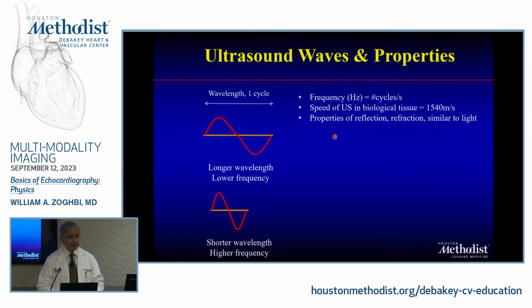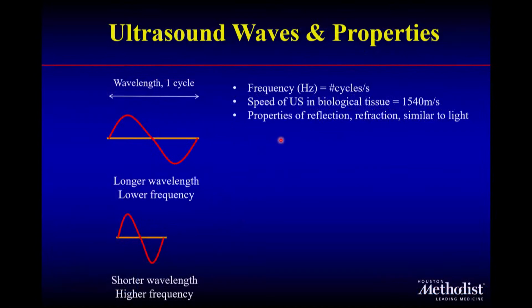When you have a transducer that has all these crystals at the top of the transducer, just like you see here, you can excite it with electricity. You could excite it mechanically, and these are mechanical ultrasound, you're not seeing them anymore. But you excite these crystals at the tip of the transducer electronically with electricity, for just a short period of time. They get deformed, and then when they relax, they emit a certain wave.